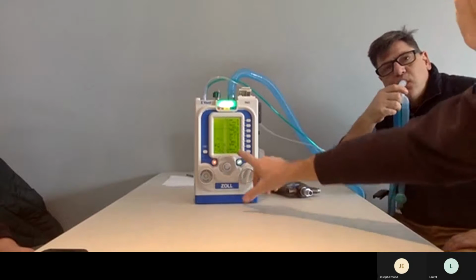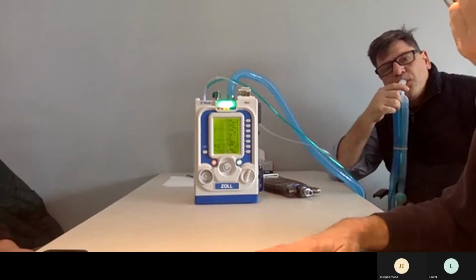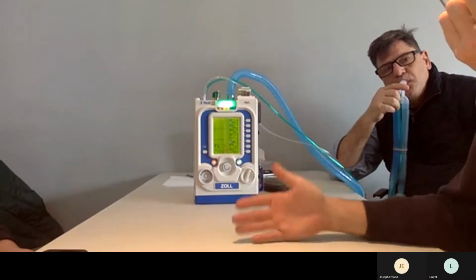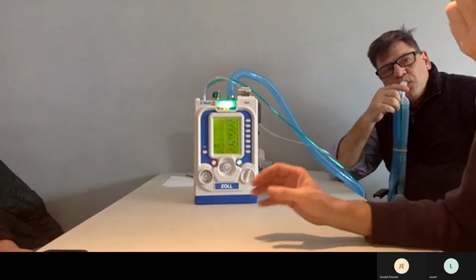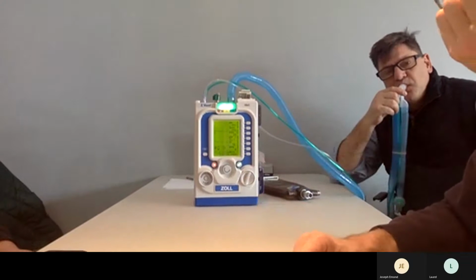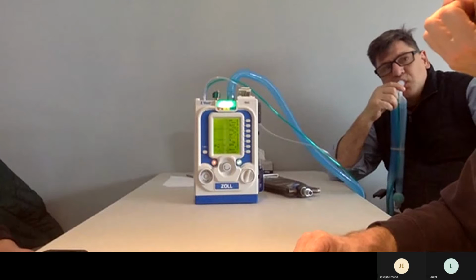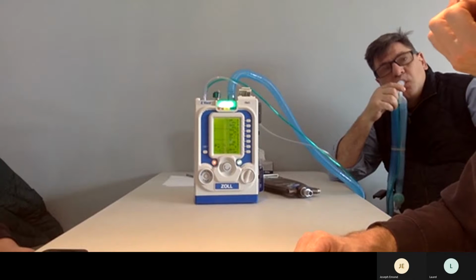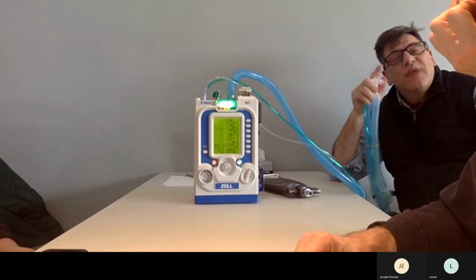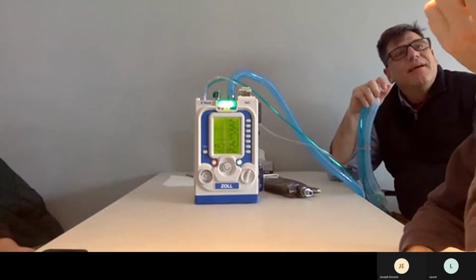So it would automatically switch, because the LTV would just give you 12 a minute as backup without the screen changing mode, but this will actually change mode. If they start breathing again, will it go back to CPAP? That's cool, so it'll switch back and forth. Wow, that is really nice. But if they're switching back and forth between apnea backup alarm and CPAP, what does that tell you? Vent them. They need to go to sleep.